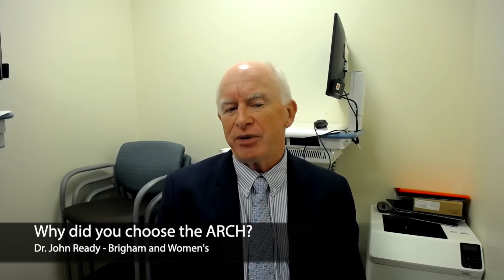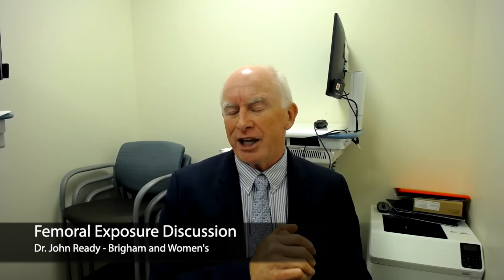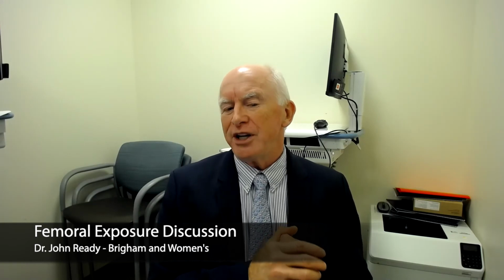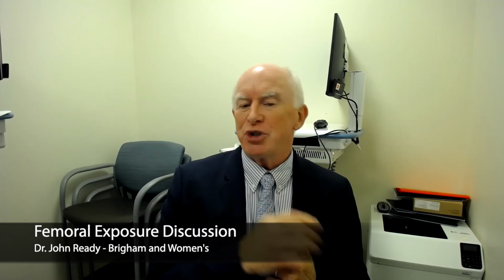our assistants found it easier to use the arch table than the Hana. You really don't need a hook. When we were using the Hana table, they showed us the hydraulic hook to bring the leg up. I found if you needed a hook, number one, you hadn't done your releases right, and number two, you're at risk of breaking something because you've got a hydraulic hook trying to force the bone into a position it doesn't want to go into. It should pop up there.